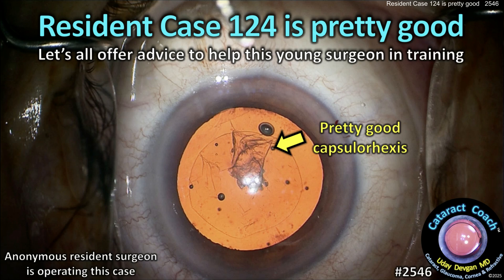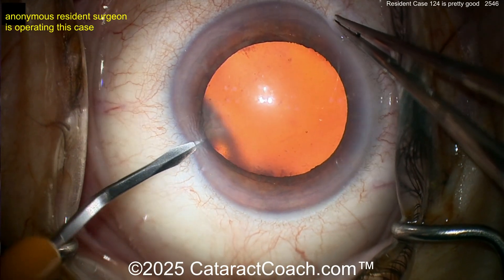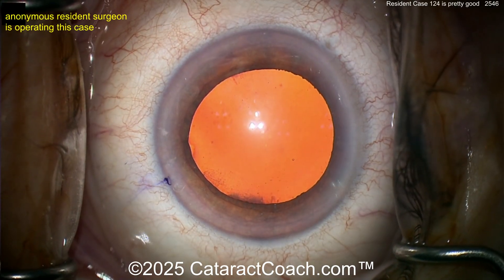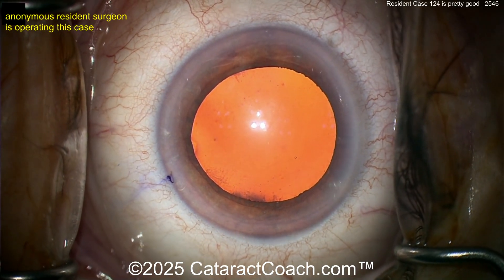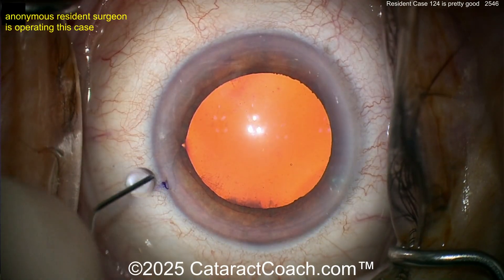CataractCoach.com resident case 124 is pretty good. Let's all come together and offer advice to help a young surgeon in training. The draping looks very nice, lid speculum is in good position, lid margin sequestered. There's a little bit of dye or ink mark on the paracentesis blade so you can see the paracentesis — that's a smart move.